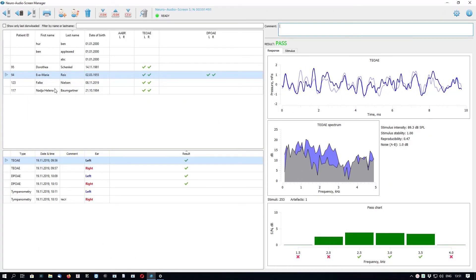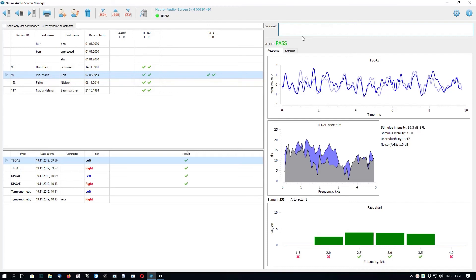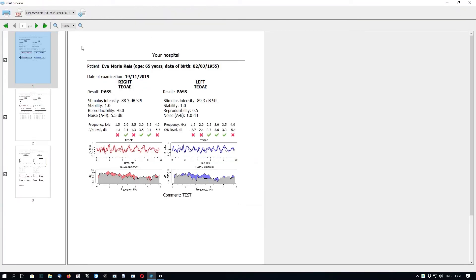NeuroAudioScreenManager has a feature to generate and print test reports. Select the patients and/or test results you want to print — selecting a patient will print all their test results. You can also type a comment in the text field, which will appear in the report. Click the Print Reports button with the printer icon. In the Print Preview window, you can preview all pages of your test report. The header shows the name of your hospital or clinic. You can print using the printer button, save to PDF, or select which printer to use. The comment you entered appears at the bottom of the page.